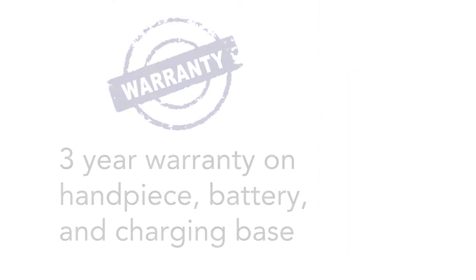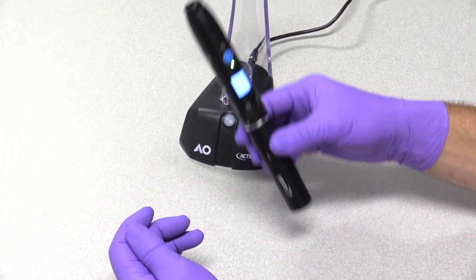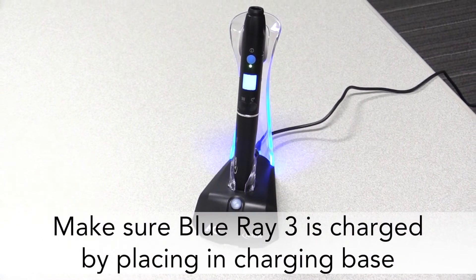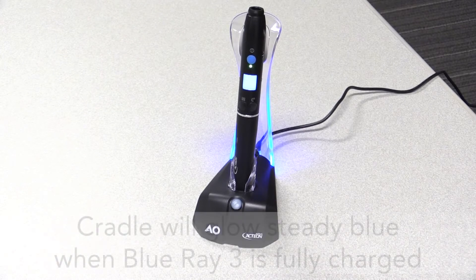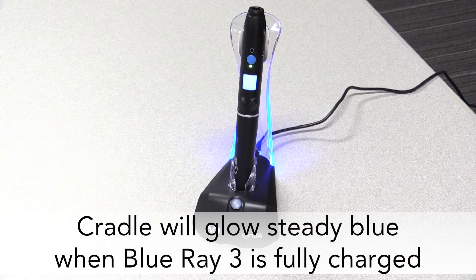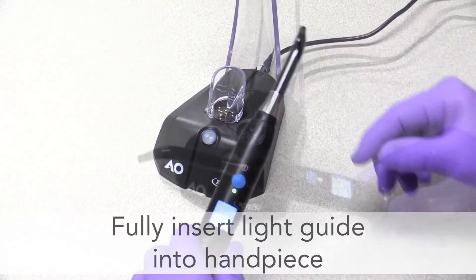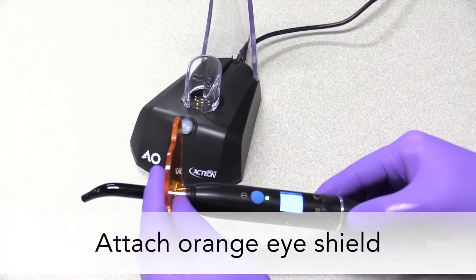Let's take a closer look at how to use Blu-ray 3. First, make sure the Blu-ray 3 is fully charged. Put the unit in the cradle of the charging base, making sure the spring-loaded contacts in the cradle make a good connection with the contacts on the bottom of the battery. The translucent cradle on the charging base will glow steady blue when the Blu-ray is fully charged. Fully insert the light guide into the handpiece, twisting the guide during insertion, and attach the orange eye shield.